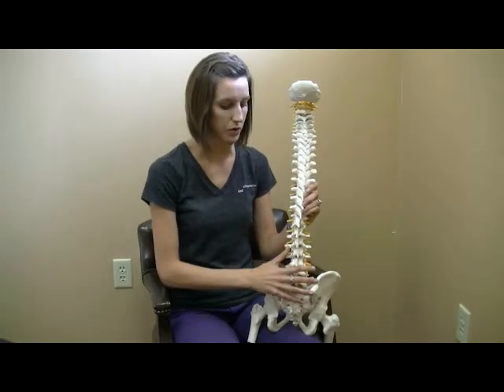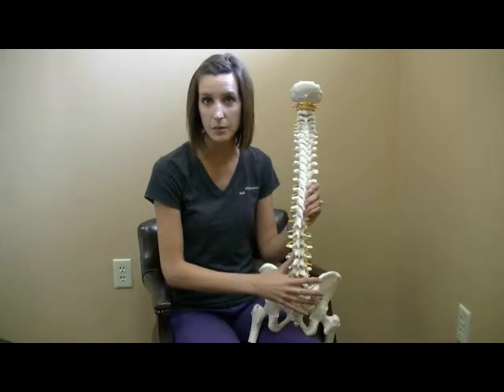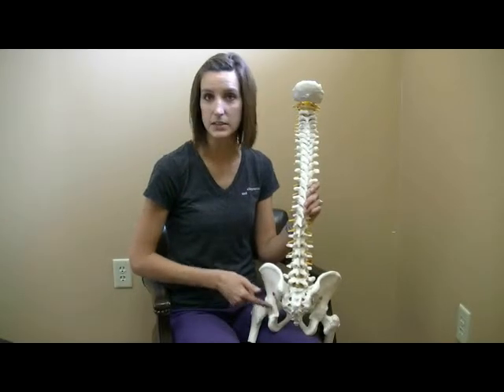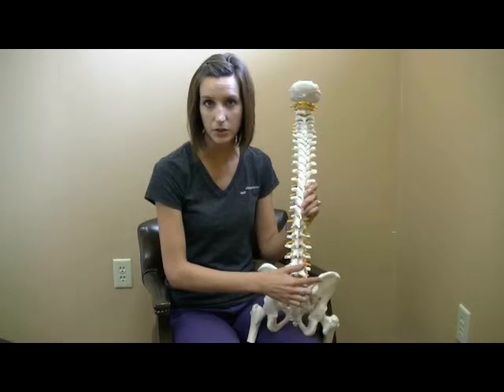So what I'm looking for usually from a straight on view is, is there curvature, how does the alignment look, but also how healthy are the joints. You can grade arthritis in the hips from this view. Also in these joints here, your SI joints is what those are called.